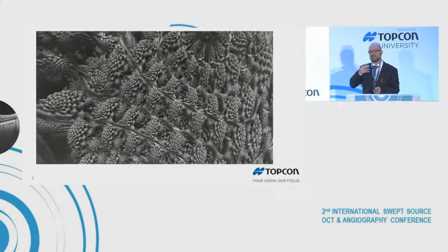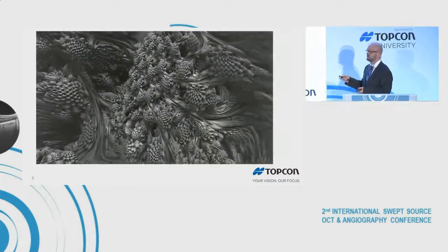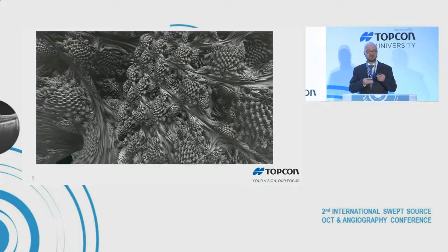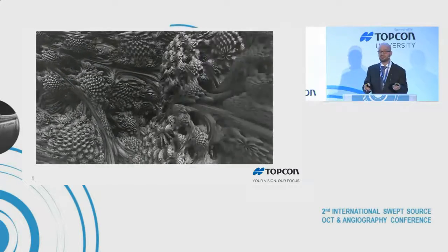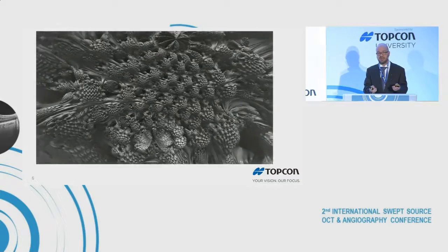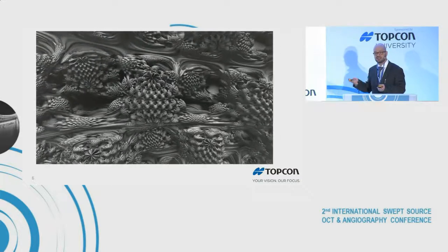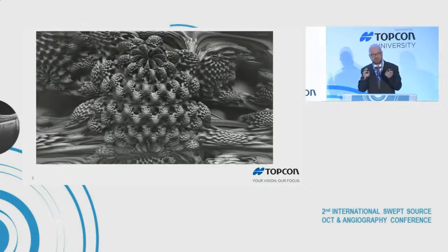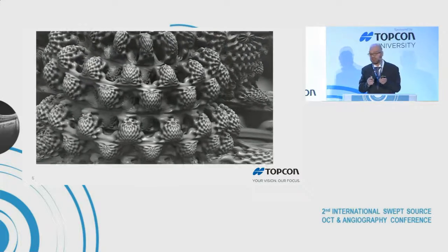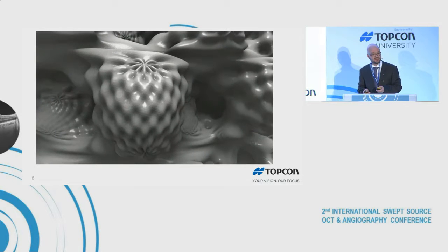So in order to visualize what this means, I created this little animation of a three-dimensional fractal. Three-dimensional fractal calculations is something that's only been around since 2009. We didn't know it existed until then. But you can actually create this understanding, and it keeps going and it keeps getting smaller. The closer you get to it, the smaller the fractal dimension can be. And then you can analyze very complex structures.